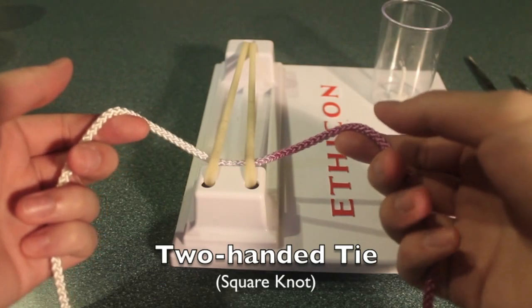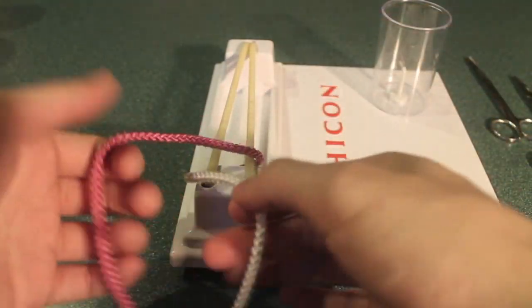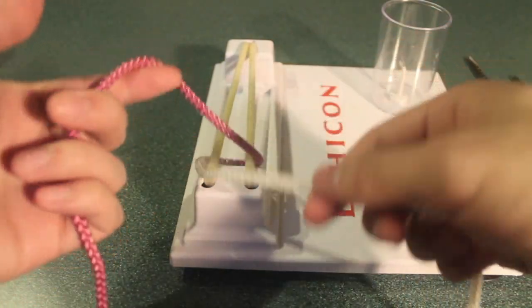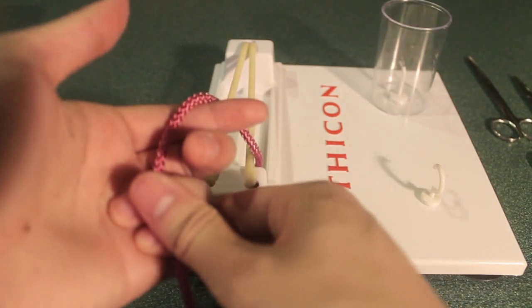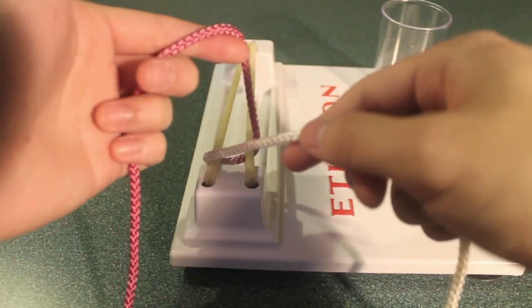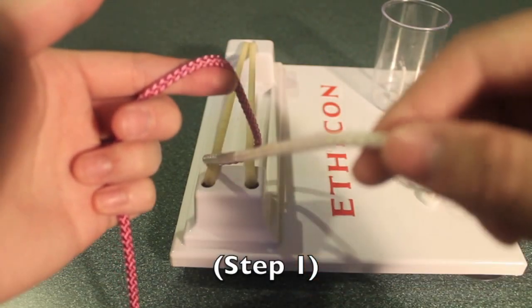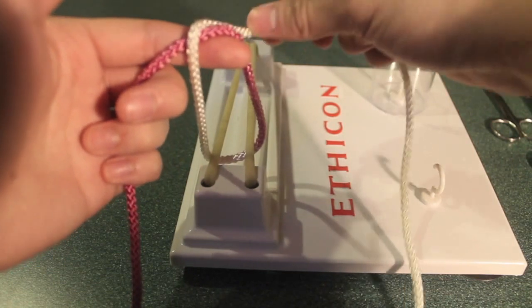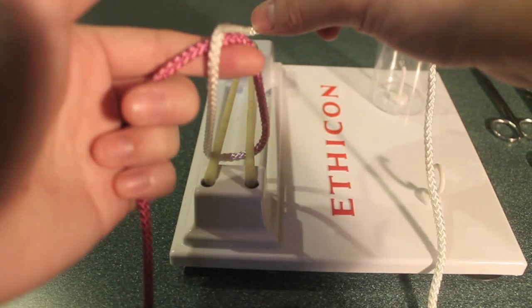Let's start with a square knot using a two-handed tie. Start with the top end of the suture in your left hand. Then we want to assume a pistol position with our hands — using our fourth and fifth fingers, hold onto the end of the suture while at the same time with our index finger we place tension onto the end of the suture. Then with our right hand, place the other end of the suture over our index finger on the left hand, thus creating a loop through which we're going to pass one of the ends of the suture to create our first twist.